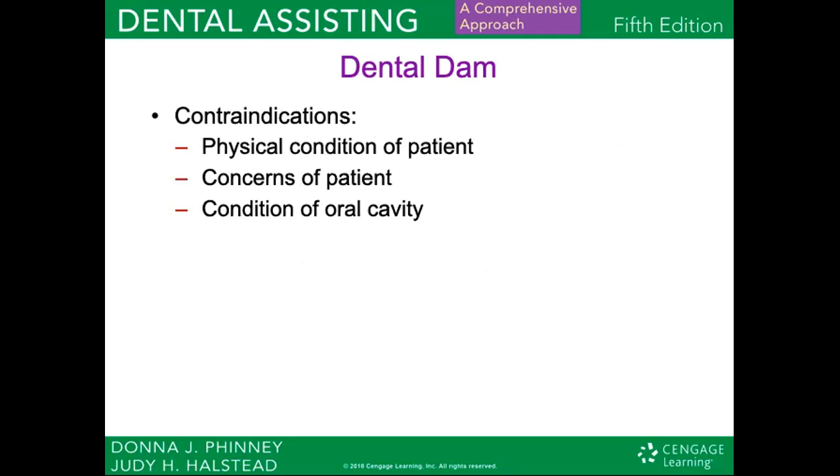So there are some contraindications, or reasons why we shouldn't use a dental dam in some instances. For patients with certain medical conditions like asthma or allergies, we may not use it. Or concerns that the patient might have, like if they're claustrophobic or might not do so well when, you know, a balloon is placed over their face, or if they have certain conditions of the oral cavity that make it difficult or impossible to use one.